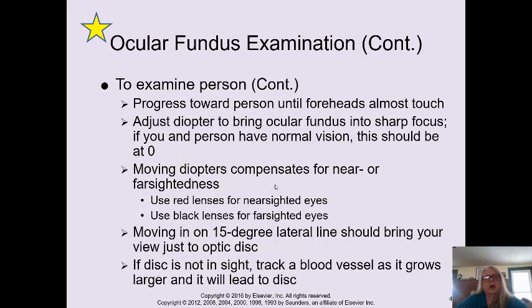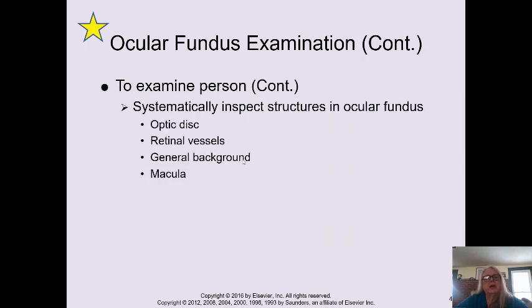And then you're looking further on back until you see the optic disc, which is orangey. No, that won't be orangey. Sorry about that. It will be sort of a pearly gray disc. And no, I'm sorry, I was right. I'm getting ears and eyes. Both are happening to me at the same time. So your optic disc is orangey, and there will be little vessels running through it if you get really back in there.